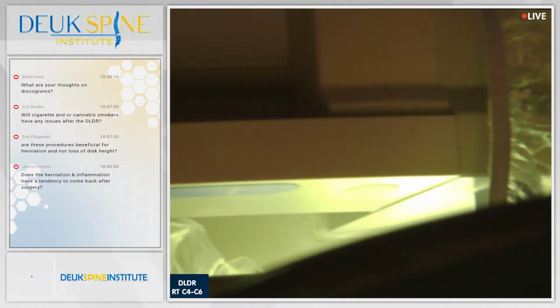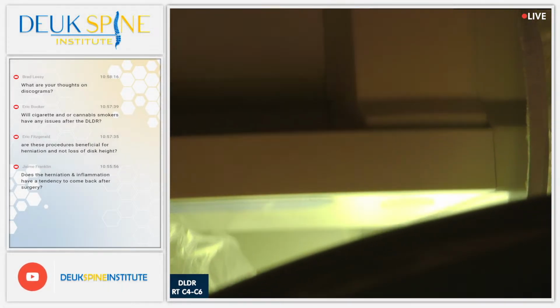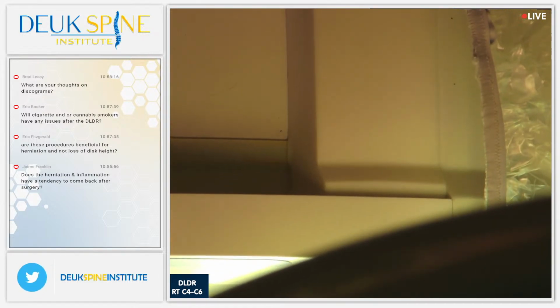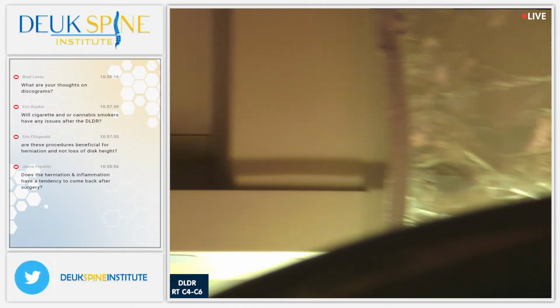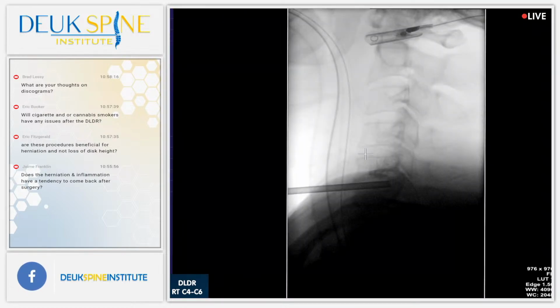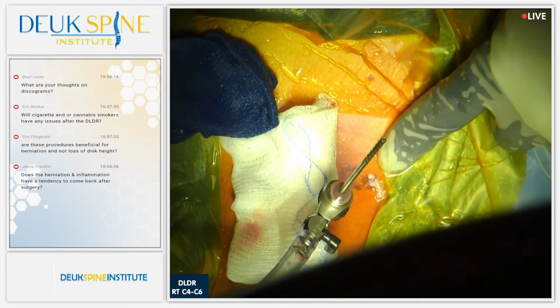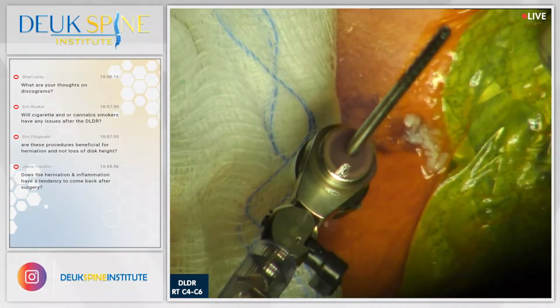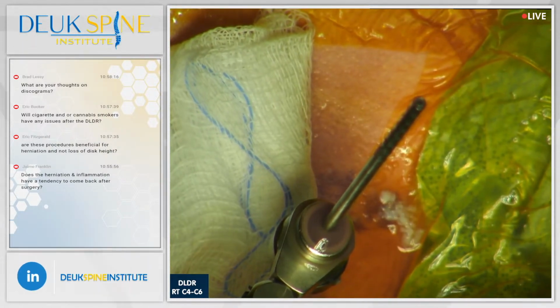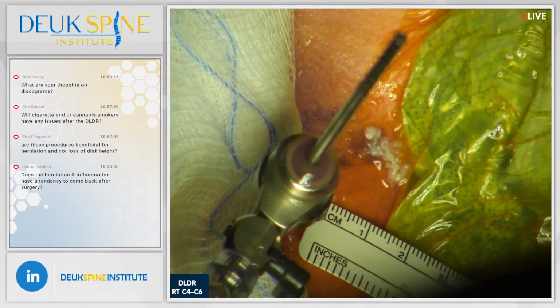Next question coming from Eric on YouTube. Hey, before we take the question, take a look right here. One moment. Lateral, please. Move your arm. Can you see right here? Yes, we can. That's a whole pile of herniated disc fragments. Look at that thing. Where's the ruler? Okay, that's about 20 pieces of herniation. They all just kind of came out of the tube and just sat there.